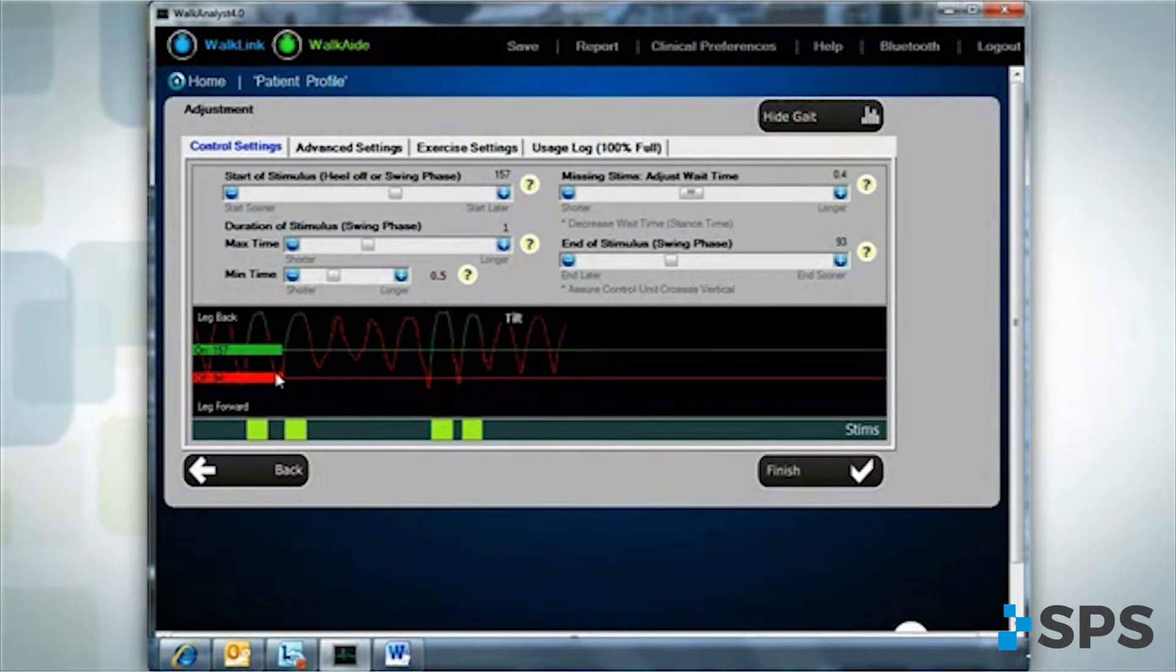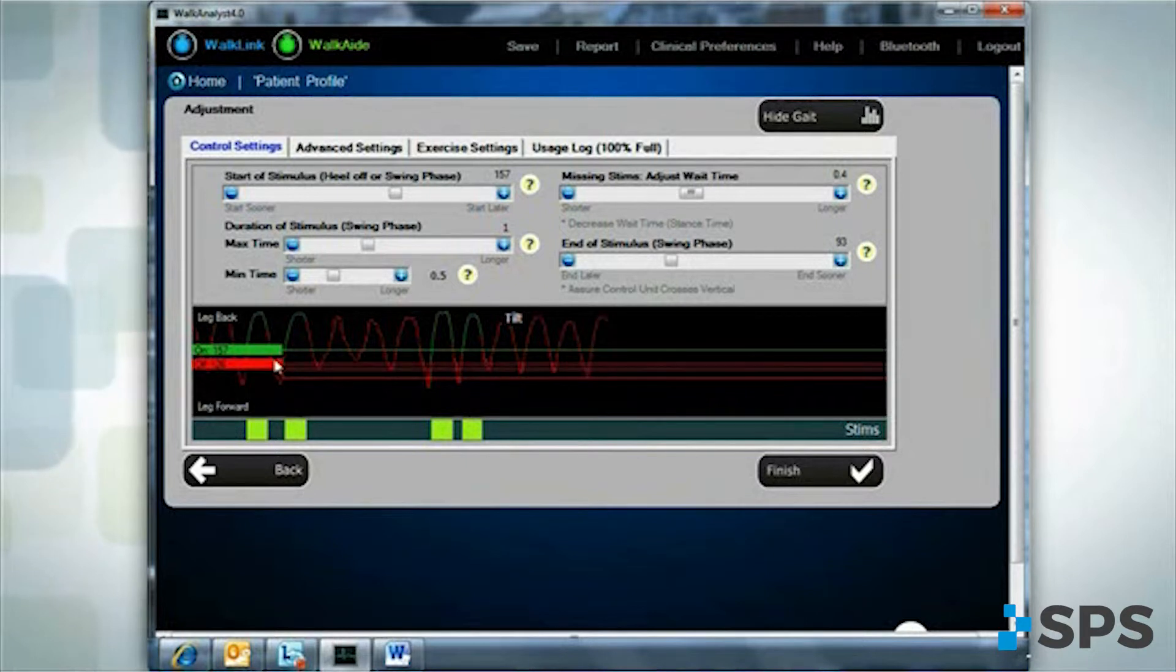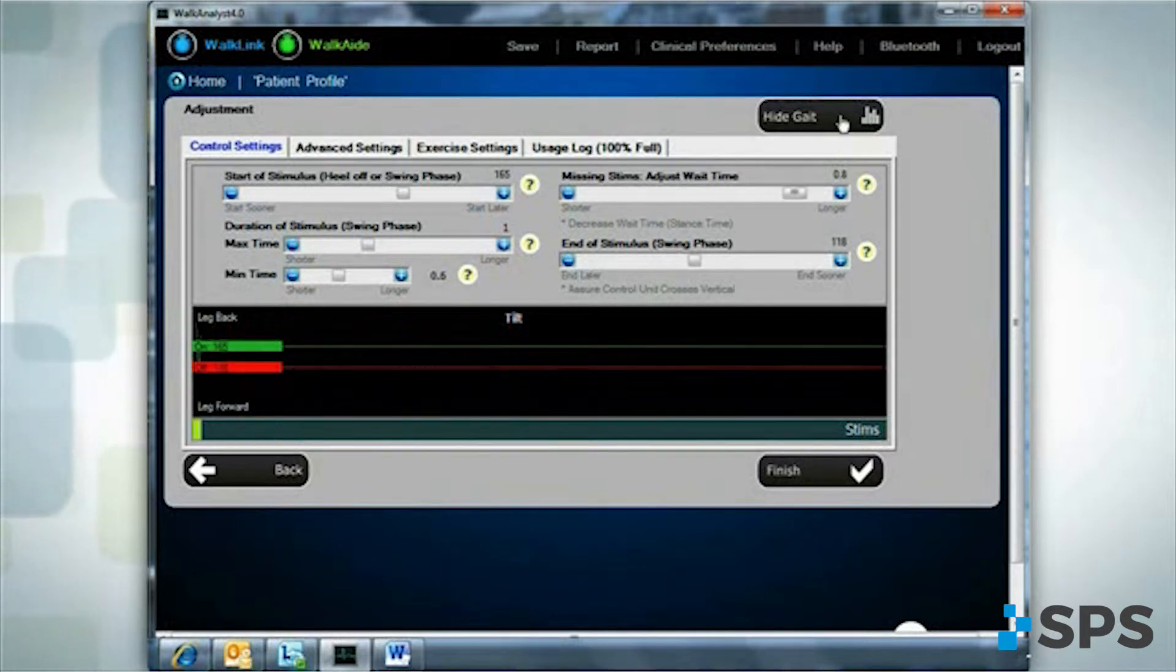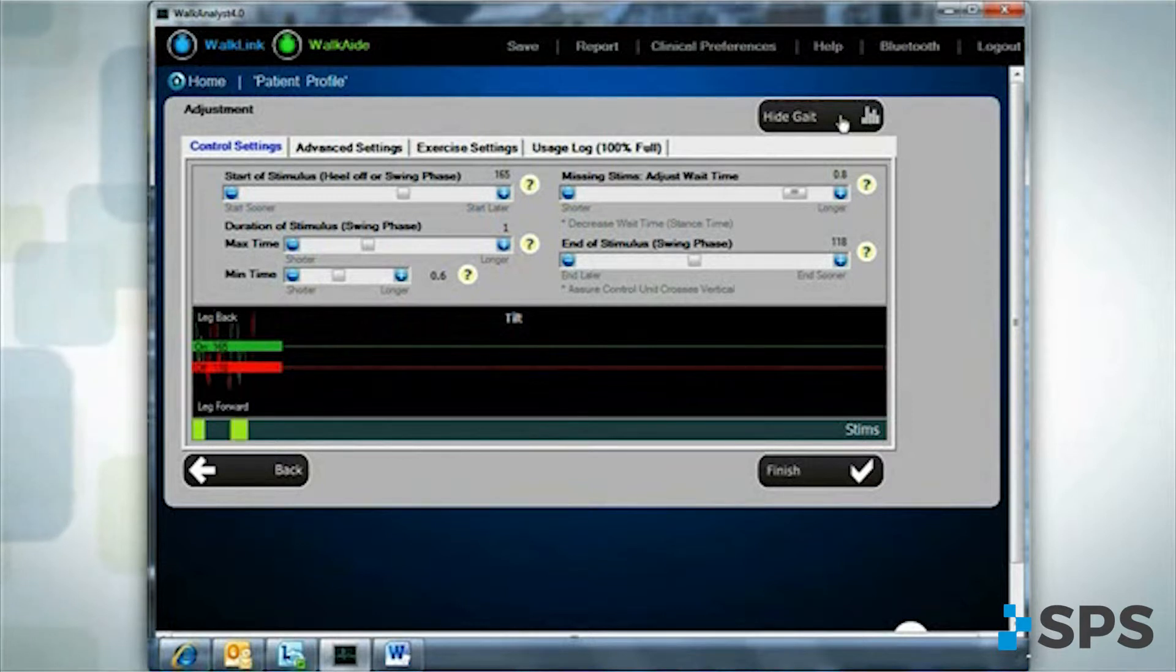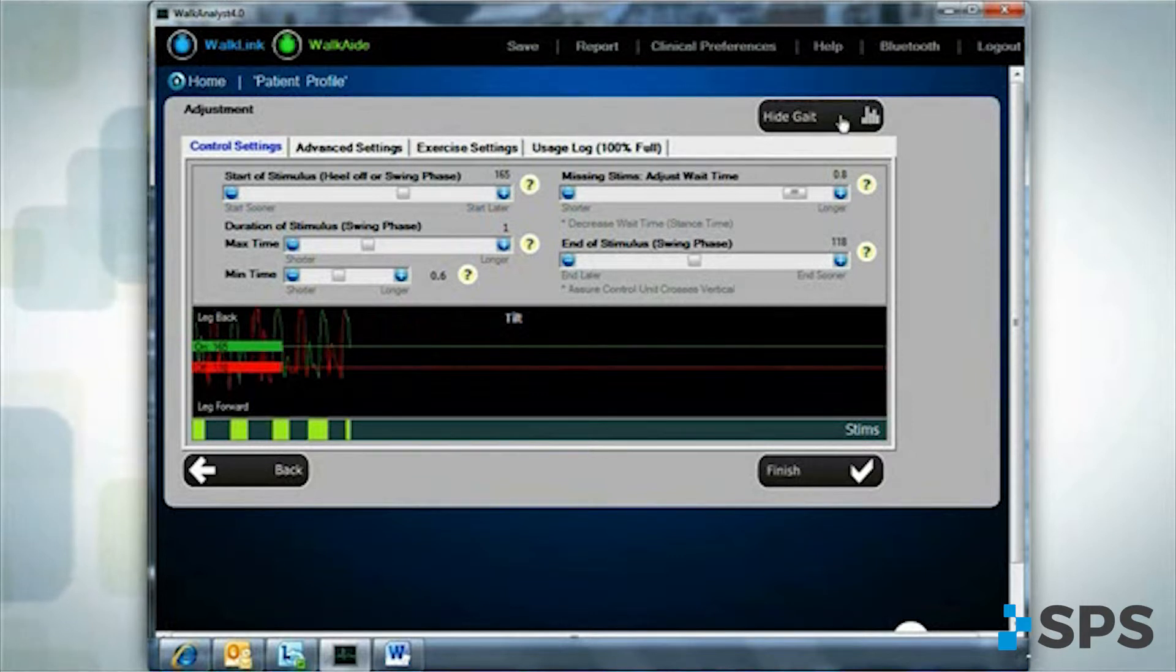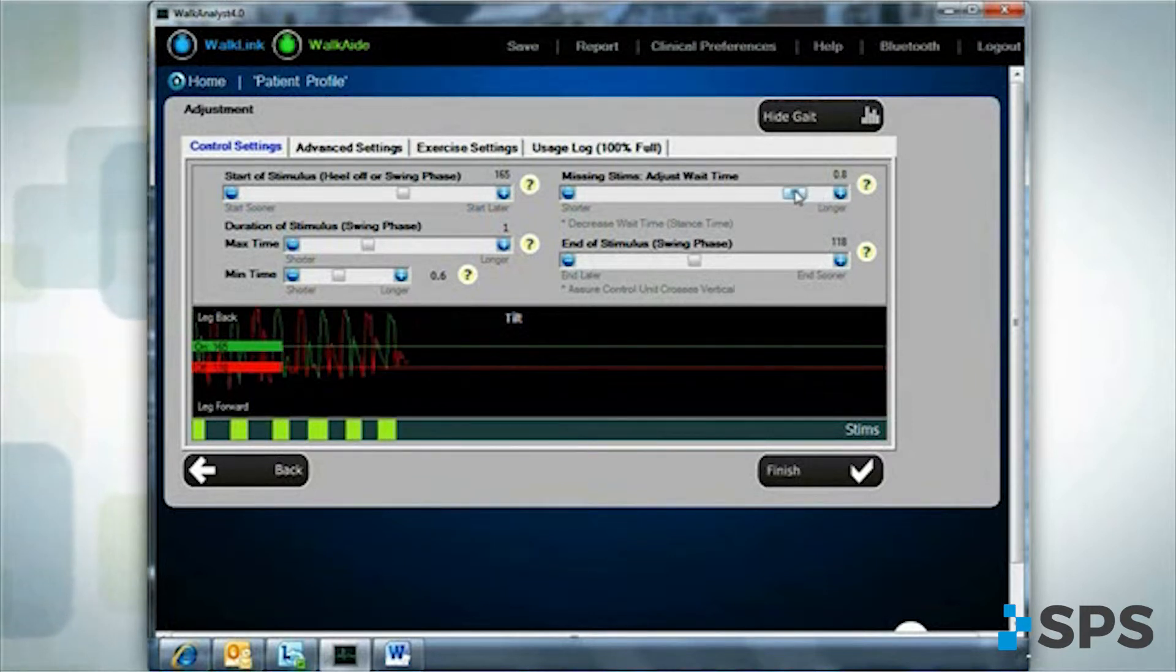If the patient is missing stimulations and you note that the walking graph does not cross the on or off threshold with every step, adjust the appropriate threshold until it is captured by every step. If all steps cross both thresholds and the patient still misses stimulations, decrease the wait time.